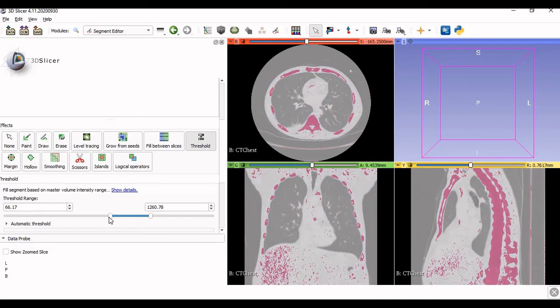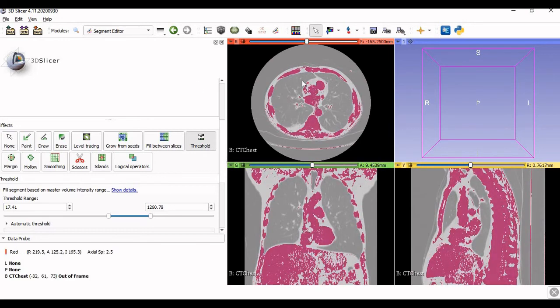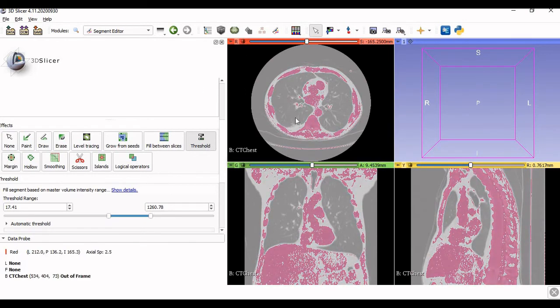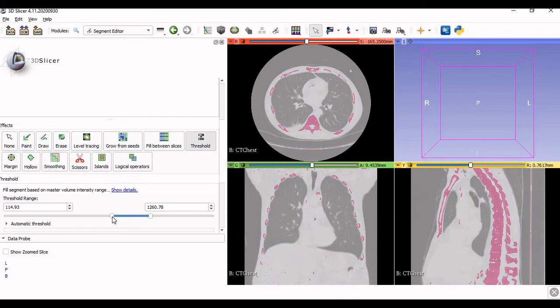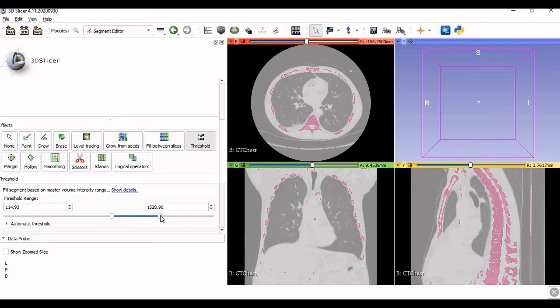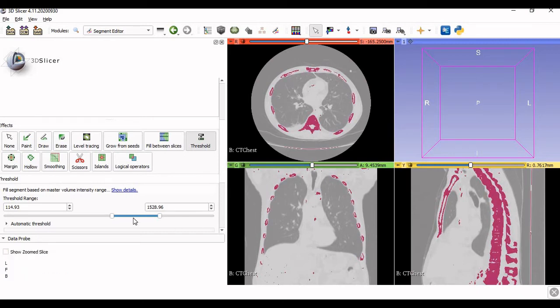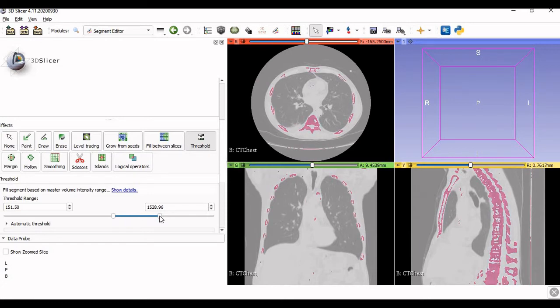As you adjust the threshold, you should judge when the outer selection has been removed and you can see just the spinal cord. You have to change the threshold such that only the spinal cord is visible in the color you have chosen. Move the slider to a sufficient value so that only the spinal cord is highlighted, and then we will proceed to editing.